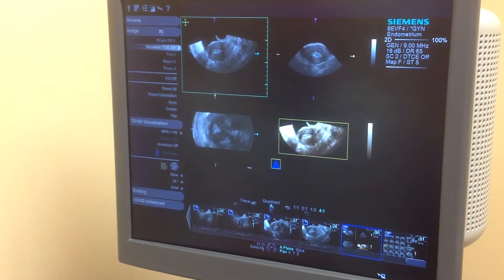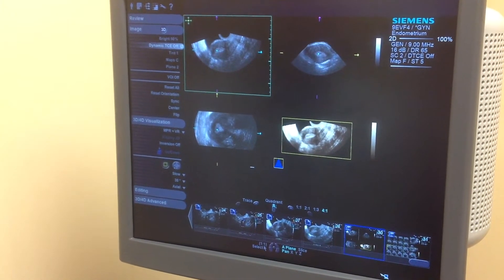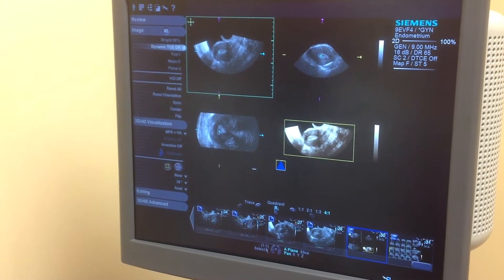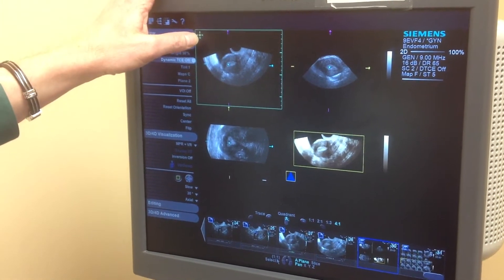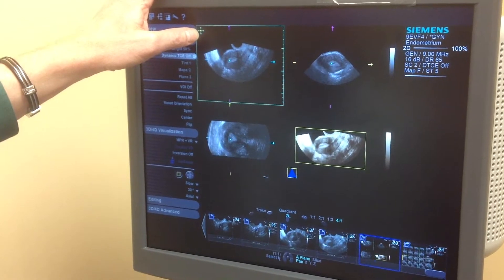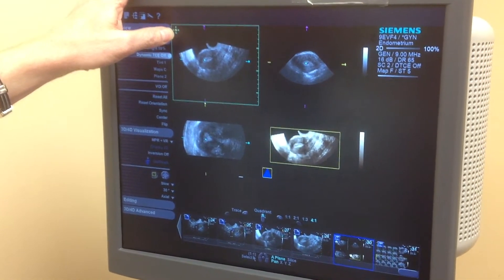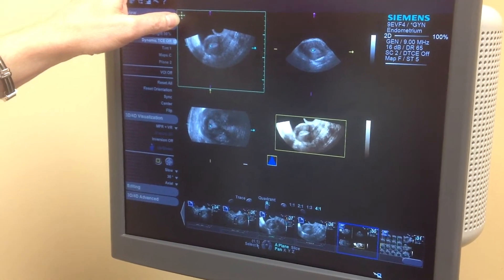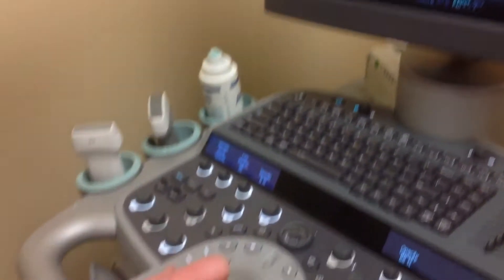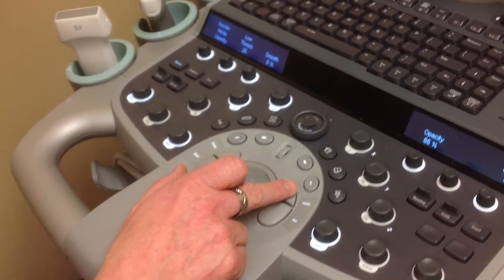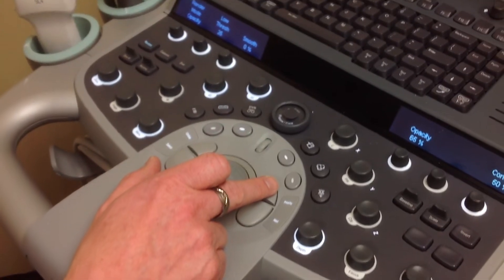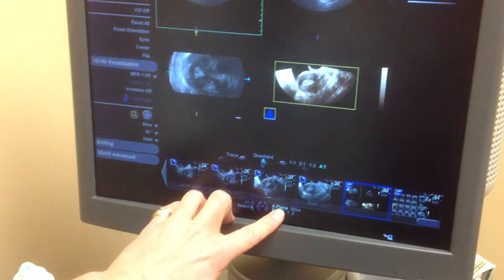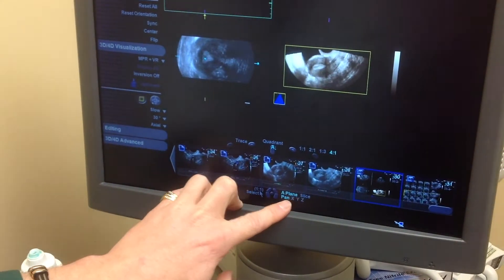I'm going to move the reference dot up into the fundus. If for some reason you don't see your reference dot, pan down to the home base and hit the priority key. When I hit the priority key, you can see what happens on the screen — the priority key controls either the plane or the slice.